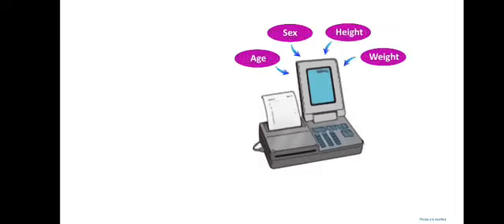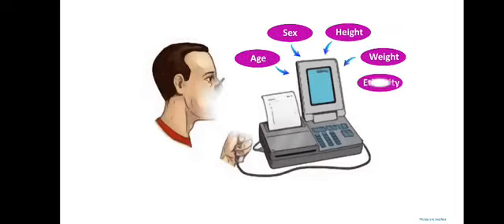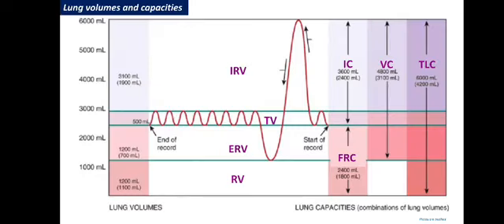Here we see the spirometer. What we need for standardization: age, sex, height, weight and ethnicity of the patient.